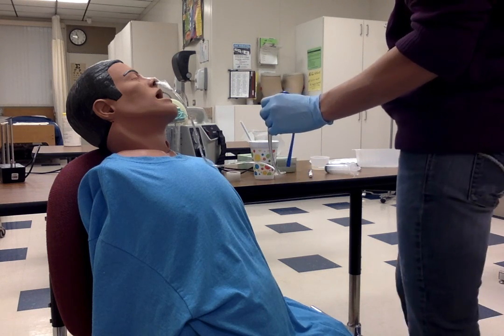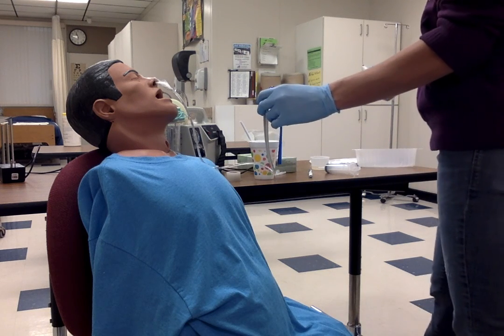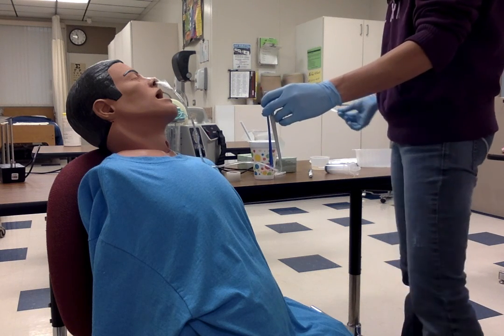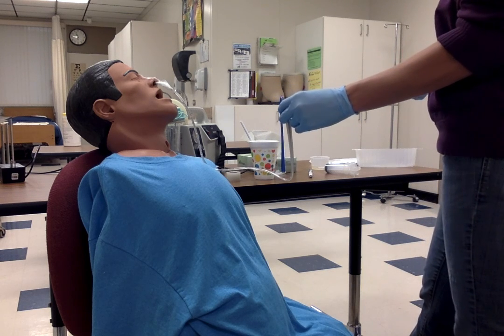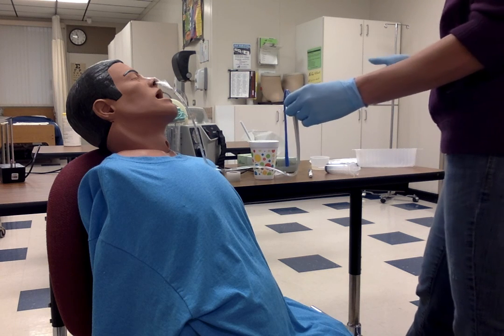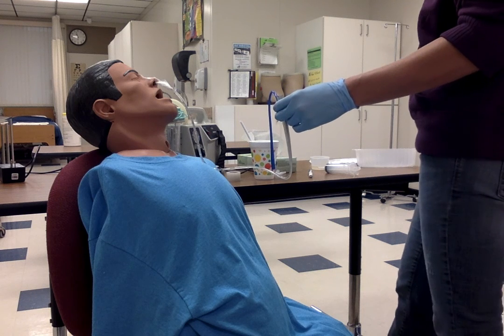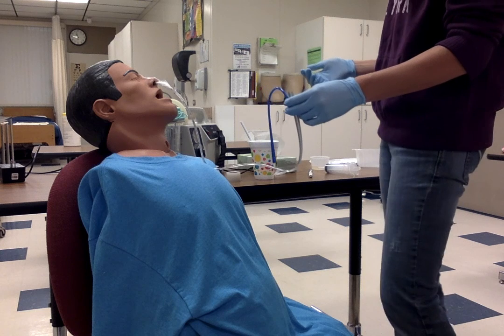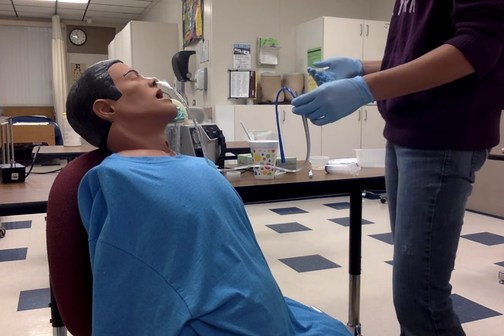So at this point, I have a pH. Let's say the pH is 3.8, we'll say. So normal is generally like 1.5 to 4. But as the number gets higher, it's more basic. So you are at a higher risk for aspiration. So you're going to want your numbers to be lower because that'll be more acidic.